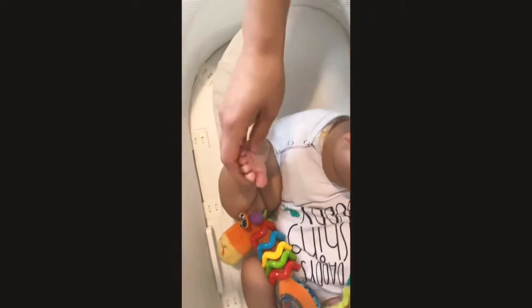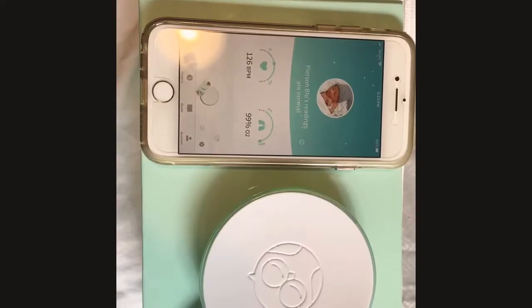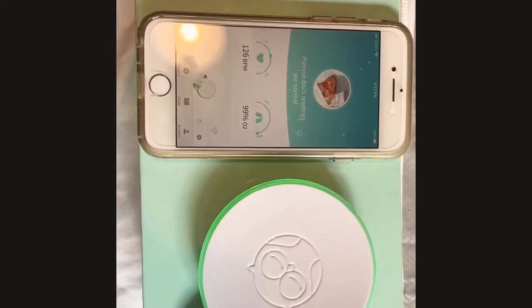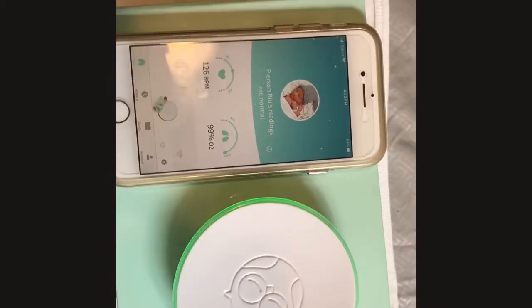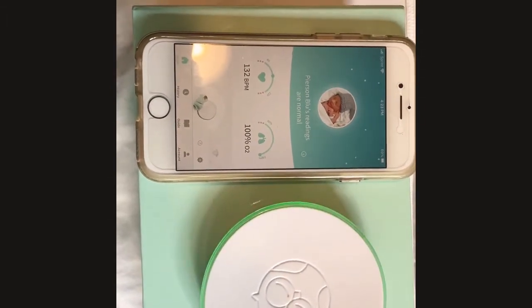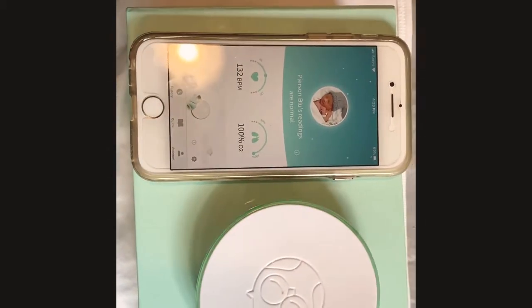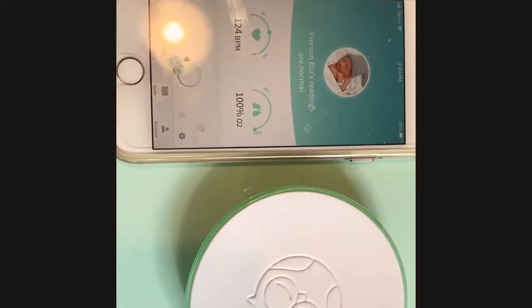You can switch it too — you can do it on the other side. So you can see here, we have a reading now. His oxygen is 99% and his heart rate is 126. You can also go through and look at the history on this app. His oxygen just jumped up to 100%.